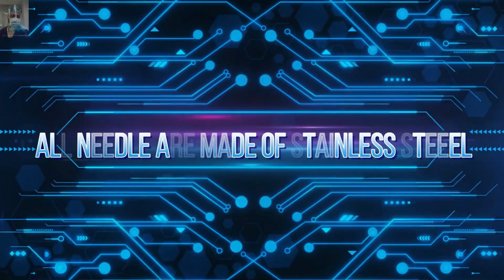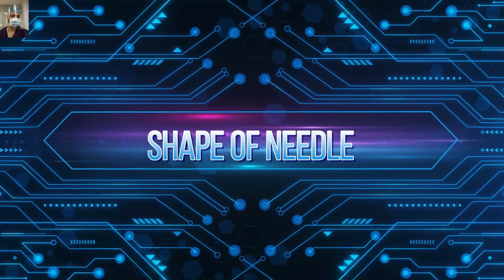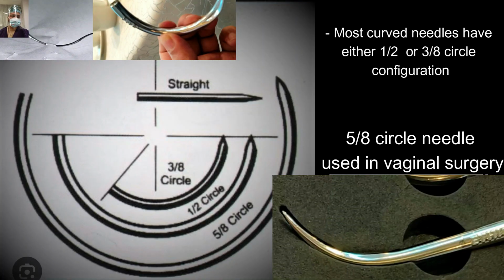So friends, for all practical reasons, all needles are made of stainless steel. There are basically three types of shapes available: one is the straight needle, one is circular or part of a circle, and another is the J shape, that is the ski needle. For all practical purposes, the straight needle is not used anymore; it is of historical significance only.